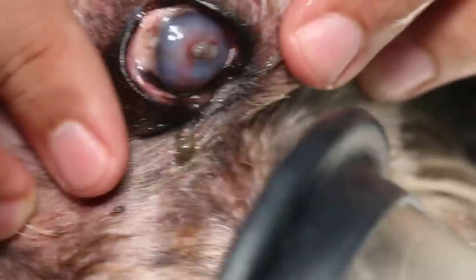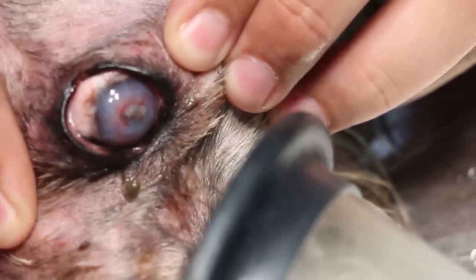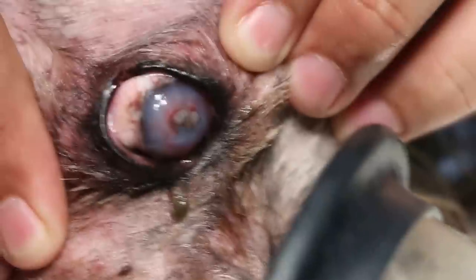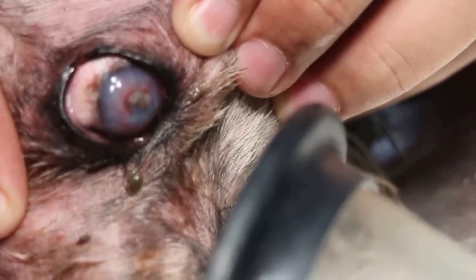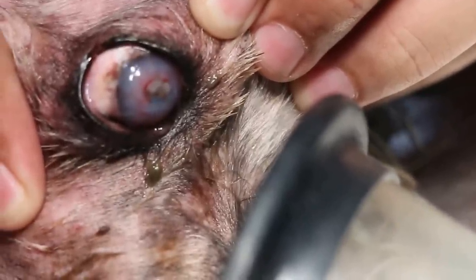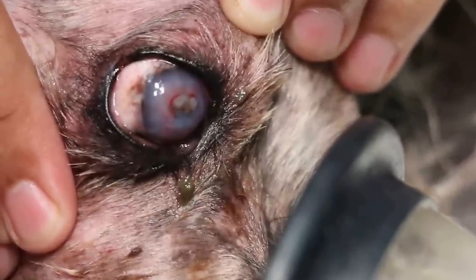Okay. Open the eyelids again. Let me have another look at the central deep ulcer. Okay, open the eyelids. Bigger, up some more. Let's see. So you can see that the ulcer has been covered by this yellowish white scar tissue, and the dog will go home and the owner will just look after it wearing the e-collar and not letting the dog run around. Then painkillers 4 days on, 4 days off, and eye drops every day, antibiotics again.